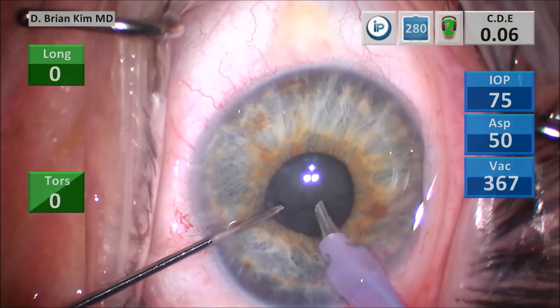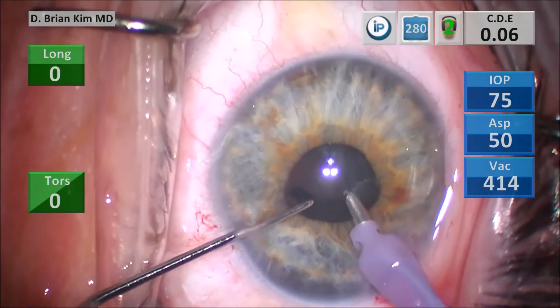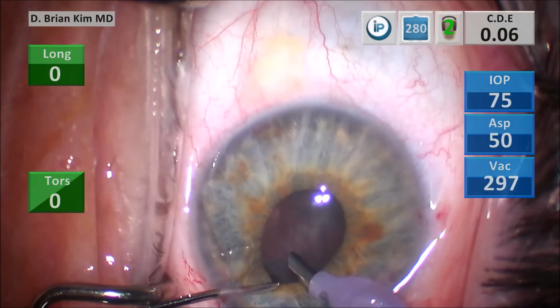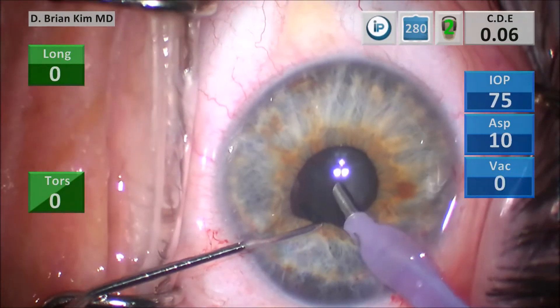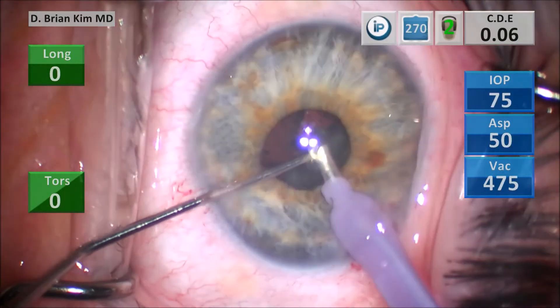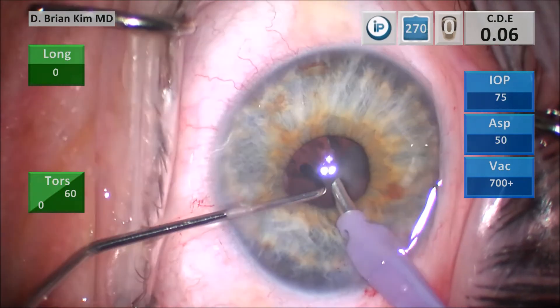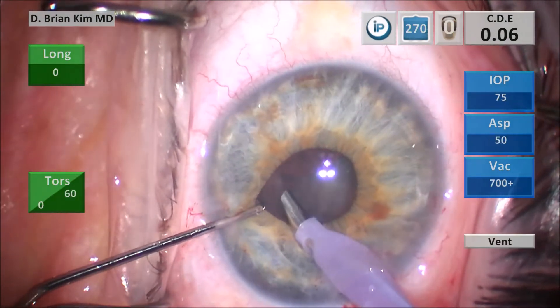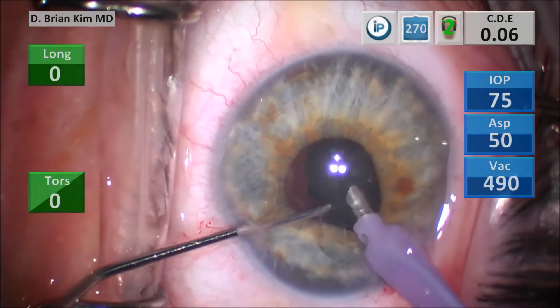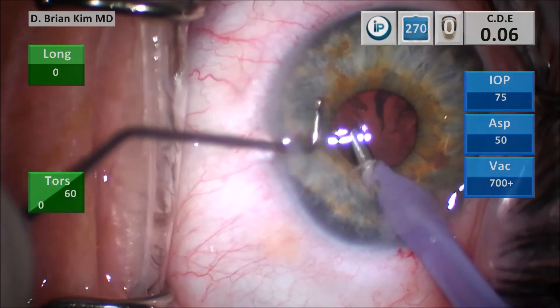You're using mechanical vector forces, using the chopper to pull the lens material into the central safe zone. As long as you keep your lens material in the central safe zone, this case is a routine cataract case. Patients tend to do very well because I'm not using rings or hooks — there is a lot less pigment dispersion at the end of the case, no pupillary distortion, very little anterior chamber reaction, clear corneas, and excellent postoperative vision right after the case.